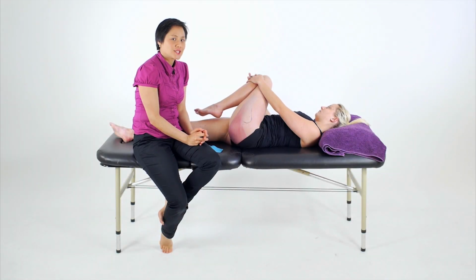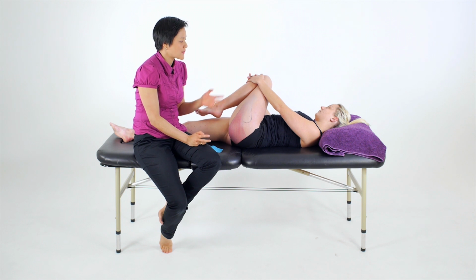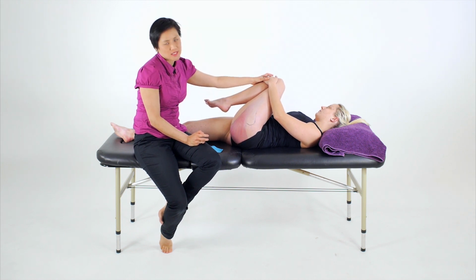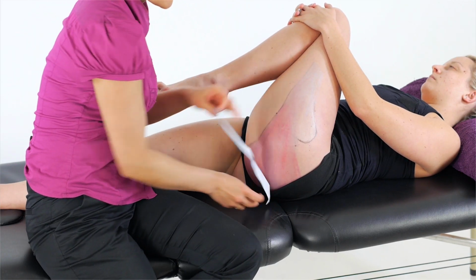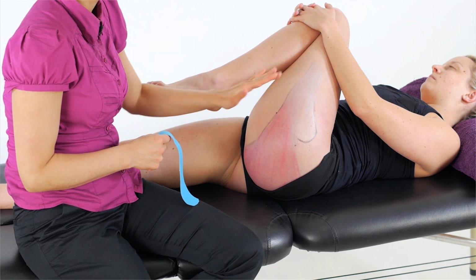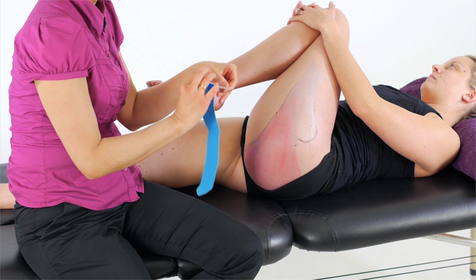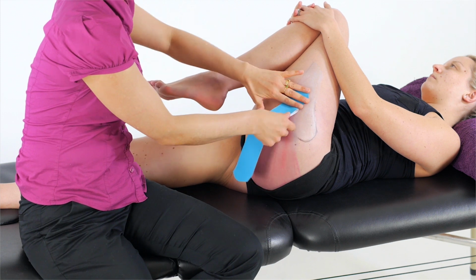For a length application to the gluteus maximus, we'll first position the client in a lengthened position, so either in supine with the knee towards the chest and the client holding that knee, or this could be done in side lying. We measure a length of tape to cover the muscle, and with the length application we're going to start at the insertion at the iliotibial band or the femur. So we roll off the initial anchor, let it settle to zero tension and place that on the femur.